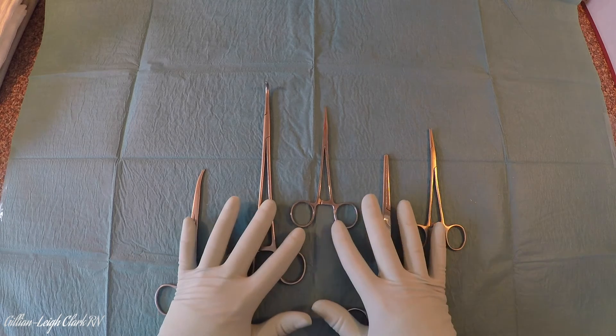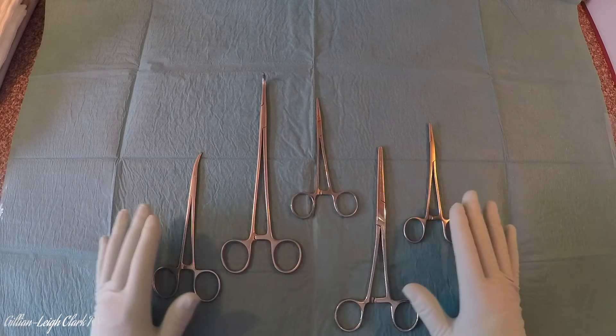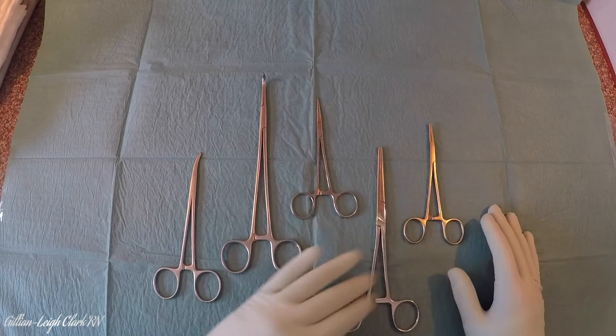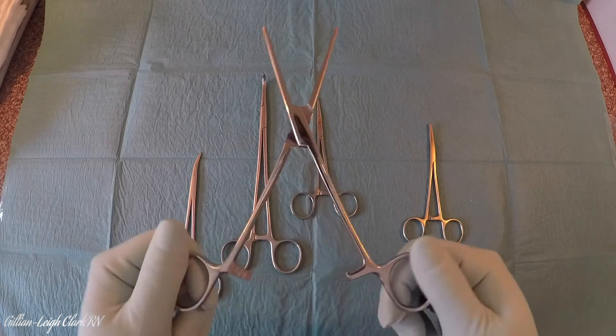I have a small selection of artery forceps here — it is just a small selection, as there are literally dozens of them, but it will give you a clue as to where you're going. Every single one of them will have scissor-like handles, and every single one of them will have a ratchet, like this.